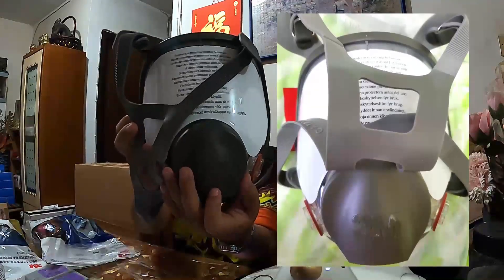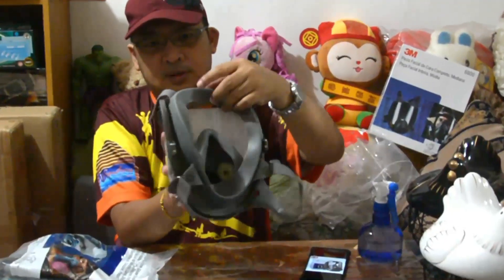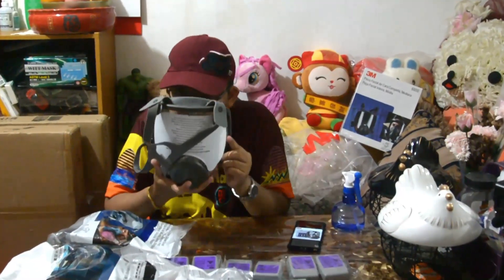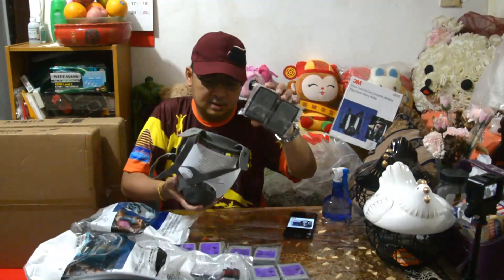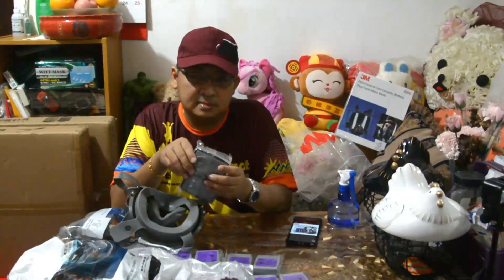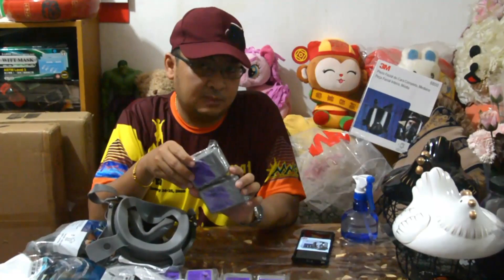May 3M siya dito, na number saka letter. Ito ay gagamitin sa hospital. Ito yung filter na gagamitin dito. Kasi yung ibang filter hindi siya pang hospital, pang painting, pang factory — hindi siya 100% na secure ka sa virus.